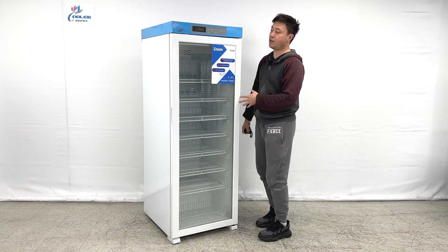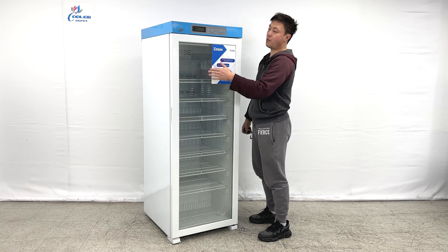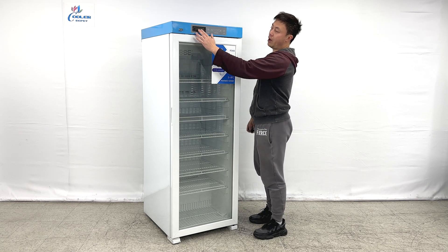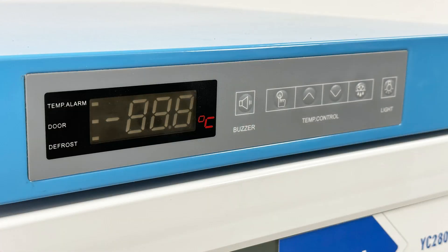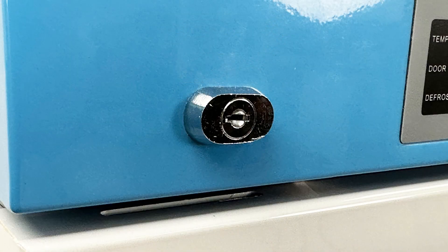As we can see, the unit comes with glass covers at the front. This glass door comes with double layers and they do have an LED display on top of it. It comes with temperature settings and has lights and defrosting settings. Also, they do have a lock on it.